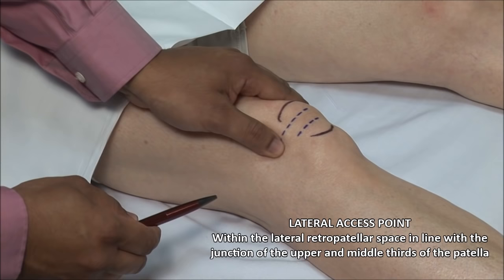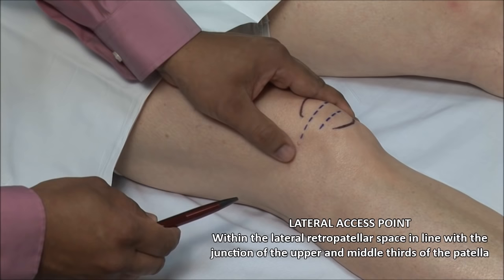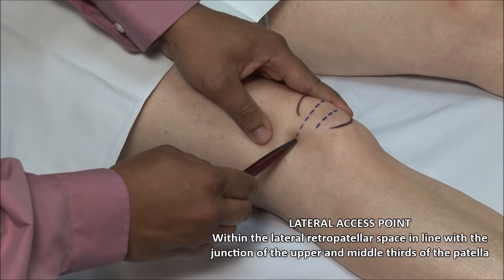It is helpful when landmarking and needling to apply pressure with the other hand medially to try to tilt the patella and open up the lateral space. Using a retractable pen, mark a point within the deepest part of the groove.